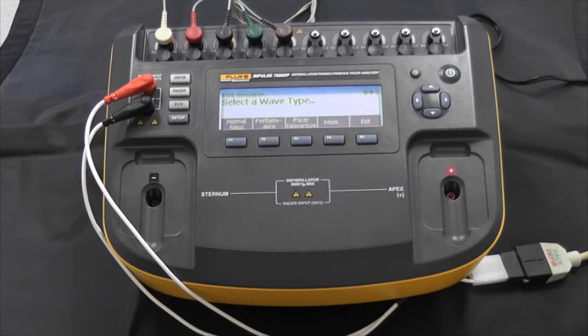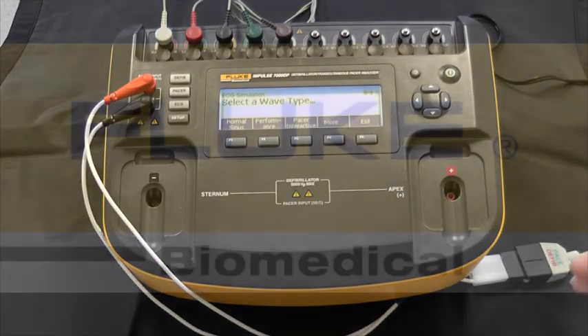At this point you've had a quick introduction to the Impulse 7000 — you've seen a test for pacer parameters and a defibrillator output test. If you want to know more, go to flukebiomedical.com. From the product dropdown, pick defibrillator analyzer and Impulse 7000. You can ask for a quote if you're ready, or if you want to try it out on your own, you can ask for a demo and we'll make sure you get a unit to try out for yourself.